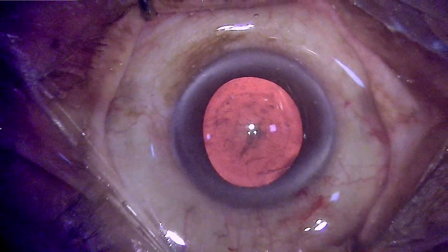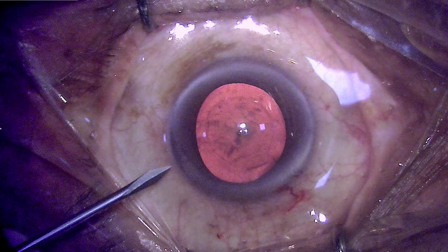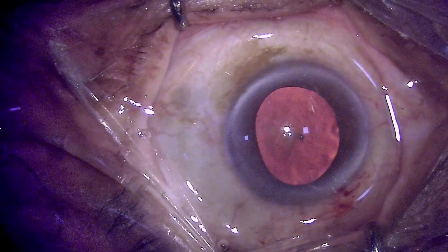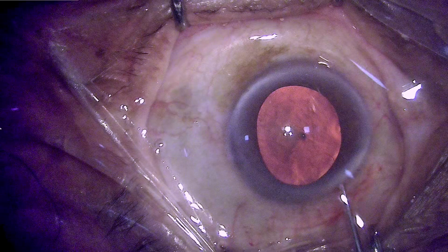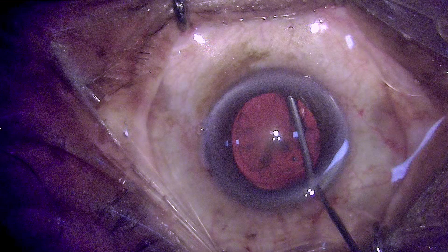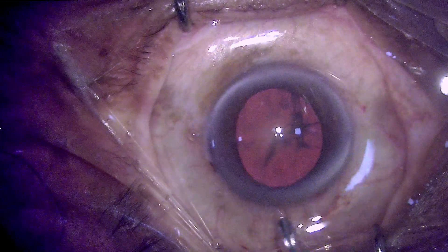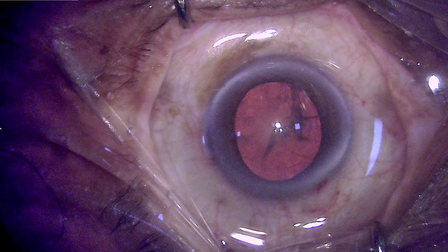Adequate size capsulorhexis has been performed and now proceeding on to making a side port. I don't use a lance tip knife; rather I prefer a MBR blade which is symmetrical and provides extension on both edges. Once the side port has been designed, with viscoelastic present, you drain out the viscoelastic and then do a hydrodissection which will help in separating the epinucleus, the cortex, and the capsule.